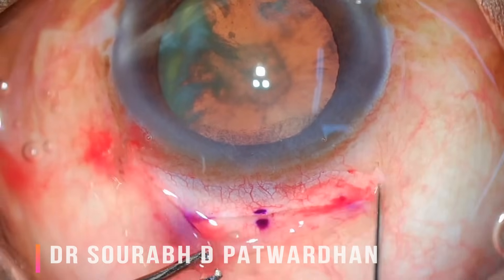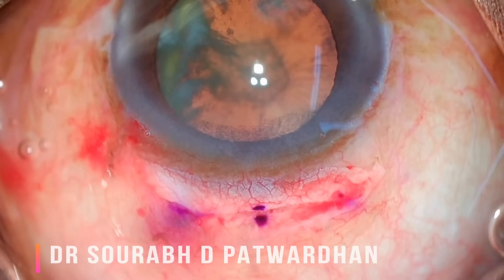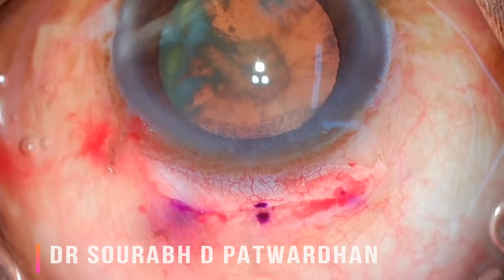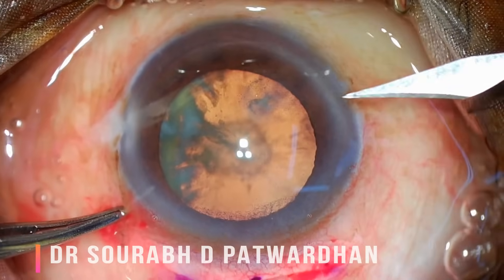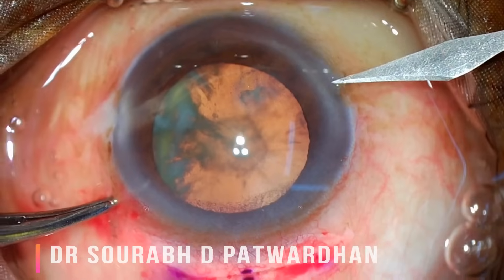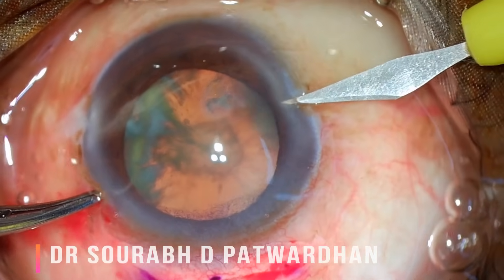Here I am showing you the points where the scleral tunnel is placed. While making the tunnel I also made some side pockets. So this is a 6-millimeter opening outside; inside there is around 8 to 9 millimeters, and the tunnel is 1.5 millimeters away from the limbus. Inside the cornea there is also 1.5 millimeters of breadth. I recommend this for beginners — you can go with 2 millimeters also, but 1.5 millimeters is enough to start with.